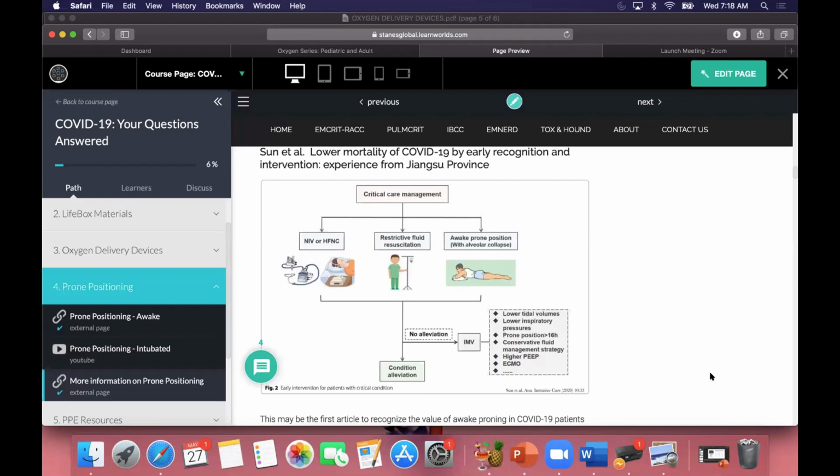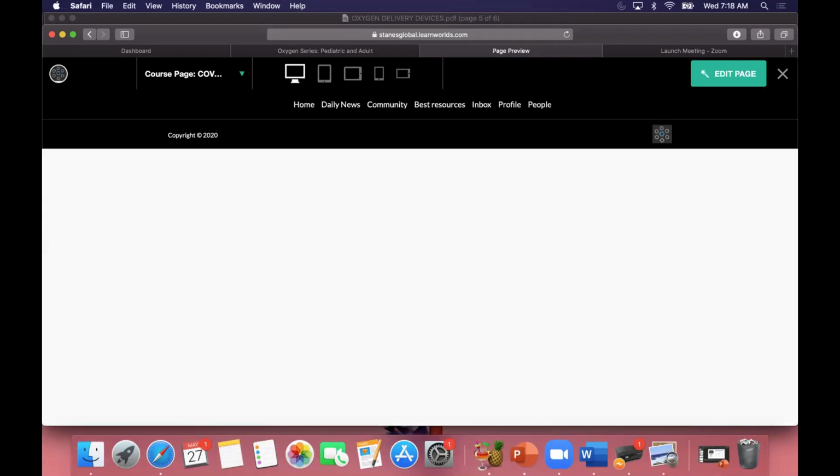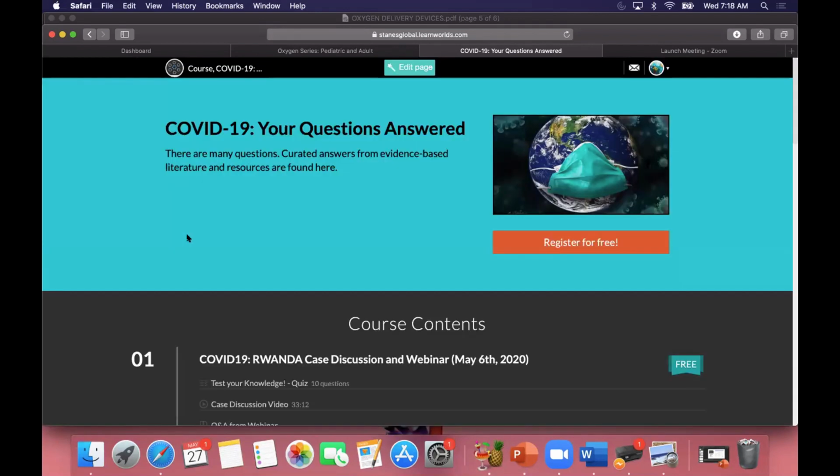So it improves oxygenation, which has direct effects on the patient, but it also evens out the potential for lung damage caused by prolonged hospitalization, by evening out the effects of alveolar collapse over time.